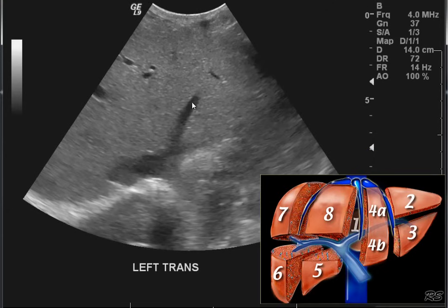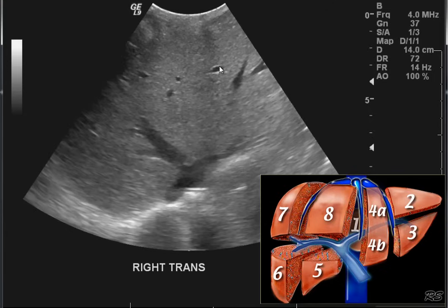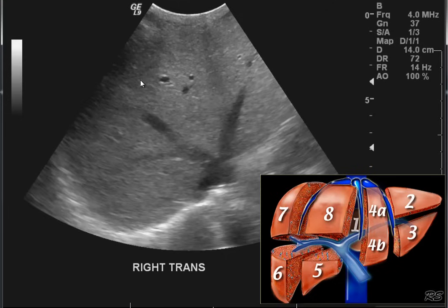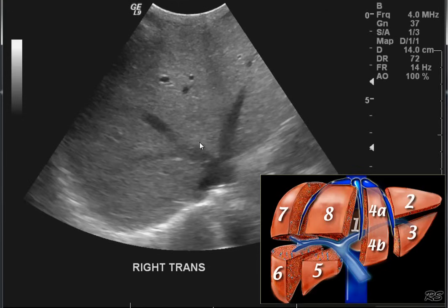This vessel is going to the periphery of the liver and joining with the cava — so this is a hepatic vein. The portal veins have bright walls. Why is that? Because surrounding the portal triads we have Glisson's capsule. So while the portal veins have bright, fibrous walls, the hepatic veins do not.